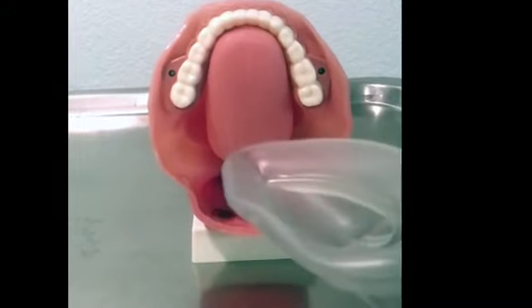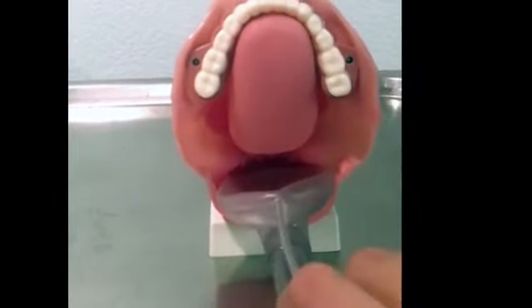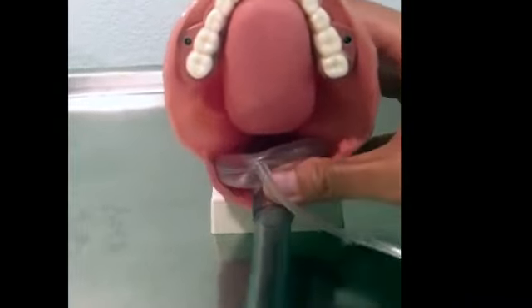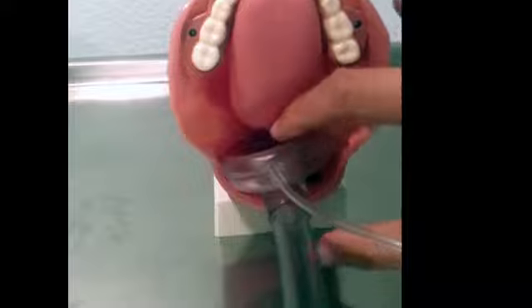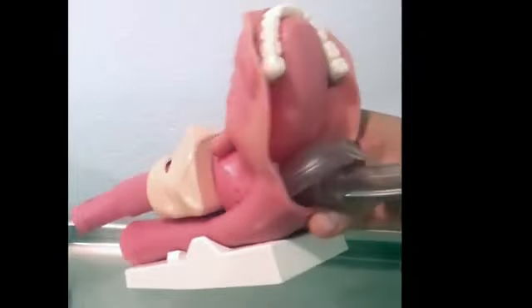Another view of when you insert this is when you're going down past the tongue, you put it in here, and it should sit comfortably inside. You inflate the cuff, and once it sits there, the air will be going through the tube. It's going to be pushing it out, and the vocal cords are right there. So that's essentially how an LMA works, and if you place it correctly, it should be like that.